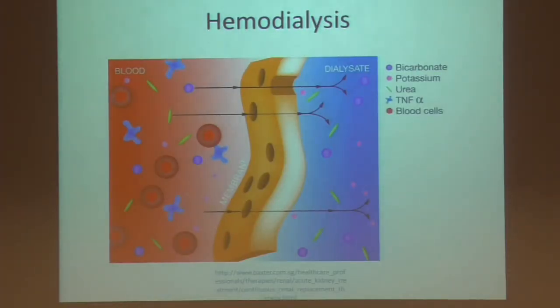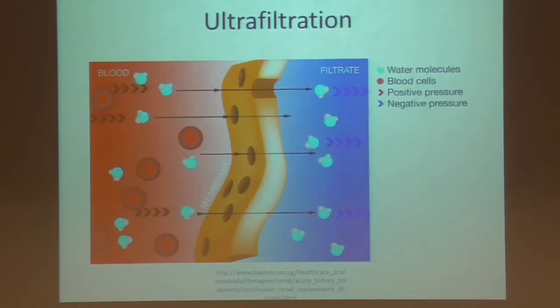So this is just a picture of hemodialysis. Obviously, this is looking at it in slices, but it's blood moving through into the dialysis through the membrane. Ultrafiltration, I just want to touch on this being an introduction. If you ever hear we're doing UF only, it's just taking fluid off, not solutes.